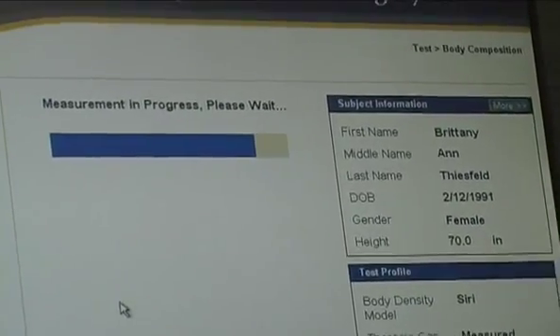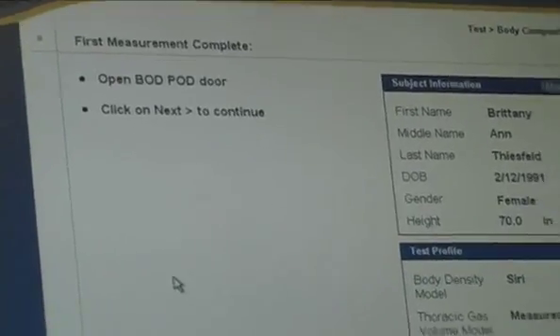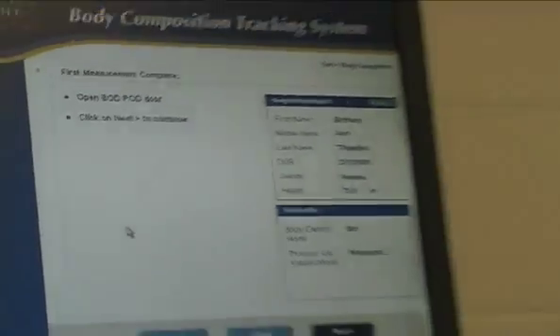Once you all get up and running, it's a 5-minute test. It's longer because we're going through and I explained some things to you. Do you need to see? So open the BOD pod door.